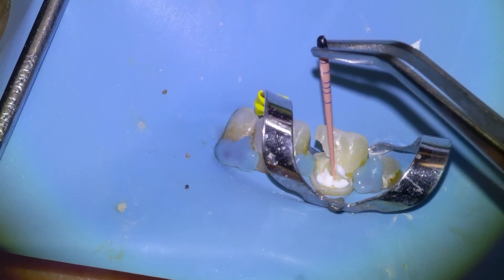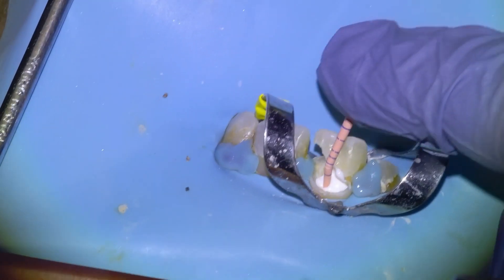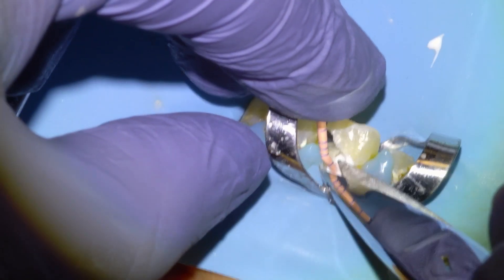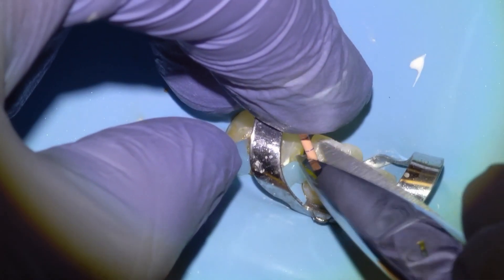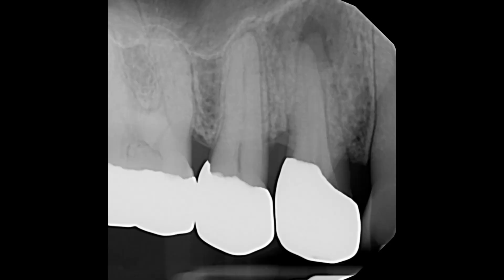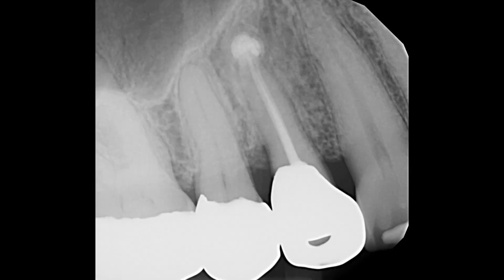The gutta-percha point will squish a little bit of sealer at the end of the tooth. We usually like to see a little sealer material go out the end, and we'll verify on an x-ray that the entire system has been filled. What does a successful root canal look like? Here's another one — you can see the dark area at the root tips of this upper right first premolar, how it looked after the root canal with sealer going out the ends of the roots, and then one year later you can see the bone has filled back in with healthy bone tissue.